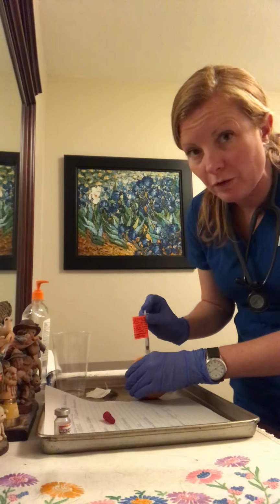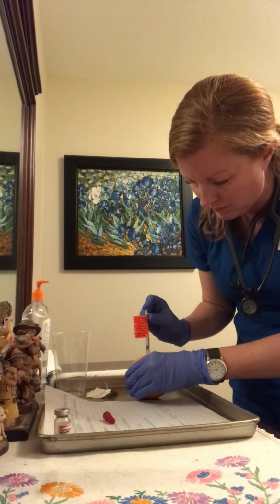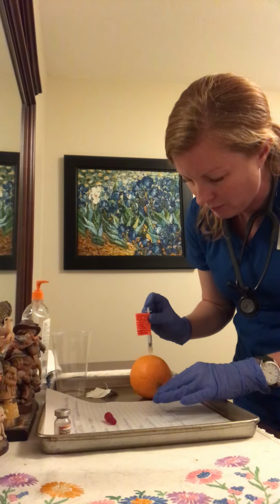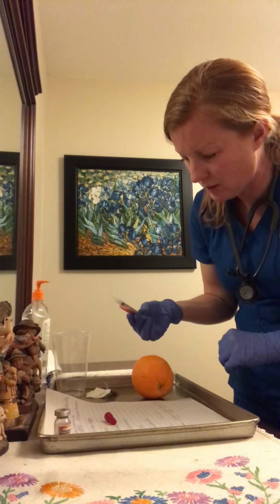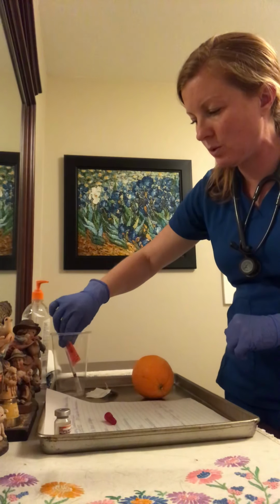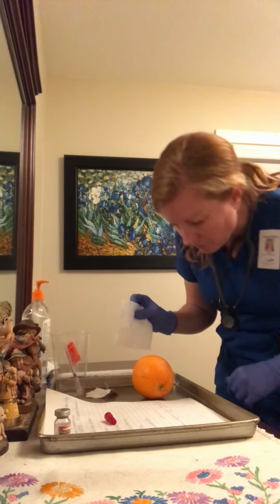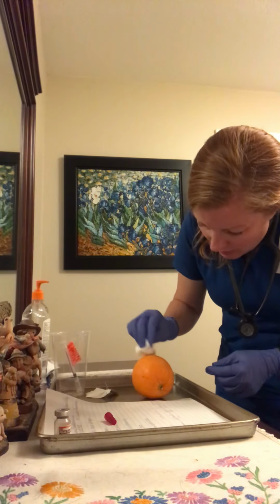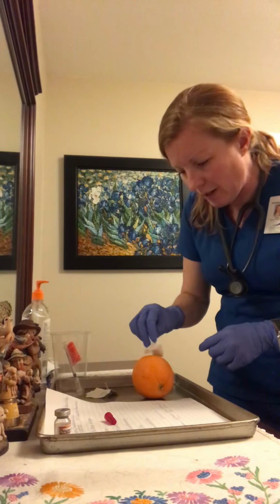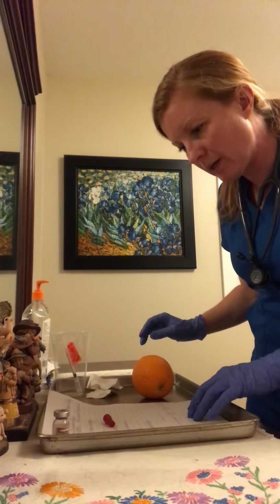And I'm going to hold for 5 seconds after I inject it. I'm going to release my hold, and then I'm going to remove my syringe. I'm going to engage my safety and put it into the sharps container right away. I'm going to look at the injection site, and maybe if there's any seepage or blood, I'm going to blot it, but I'm not going to massage it or press hard, so we're looking good there.